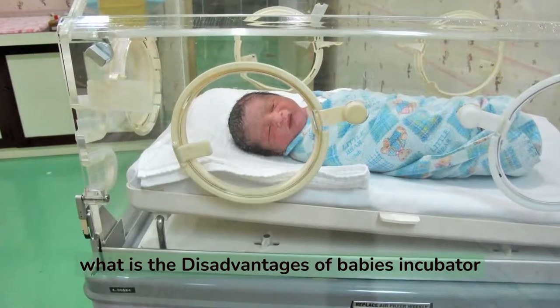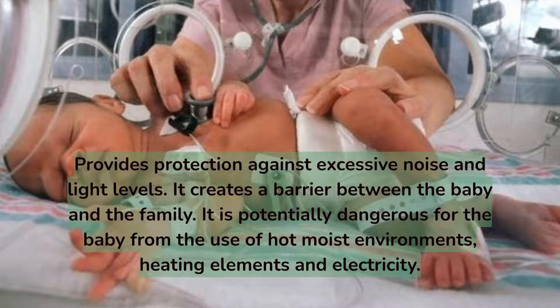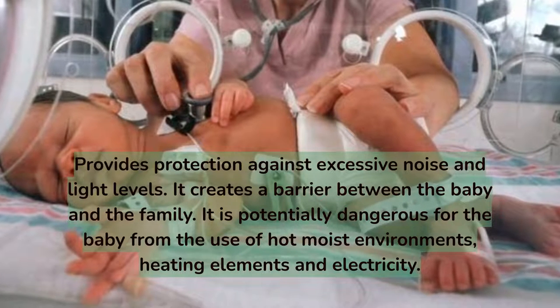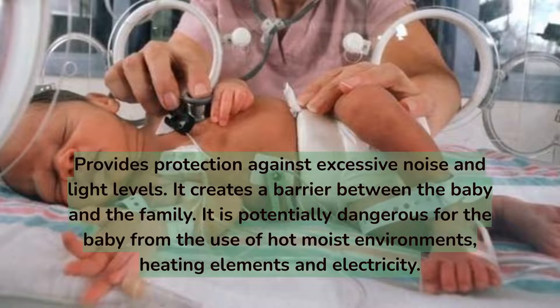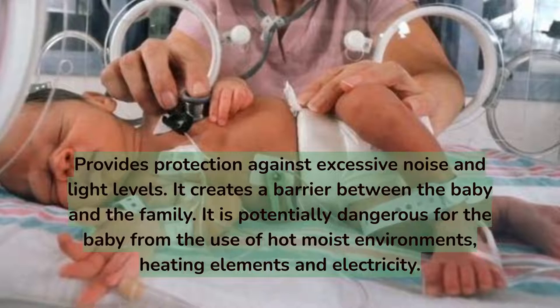What are the disadvantages of a baby's incubator? It creates a barrier between the baby and the family. It is also potentially dangerous for the baby due to the use of hot, moist environments, heating elements, and electricity.